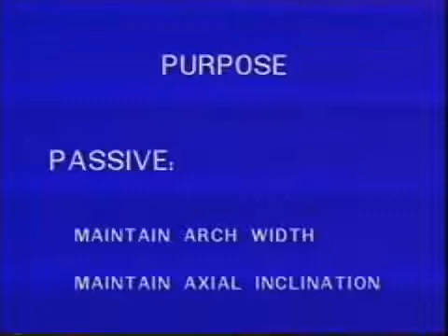Axial inclinations are maintained with a high degree of fidelity by the close and accurate fit of the wire within the sheath.